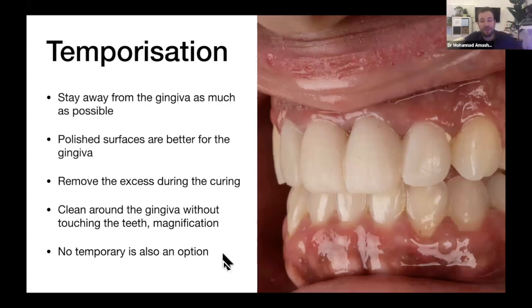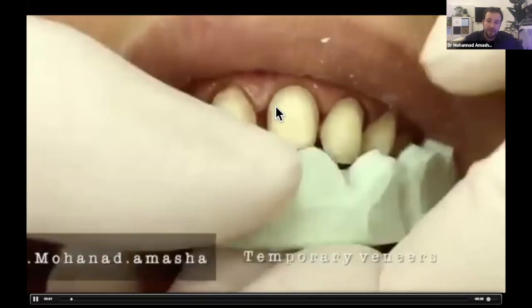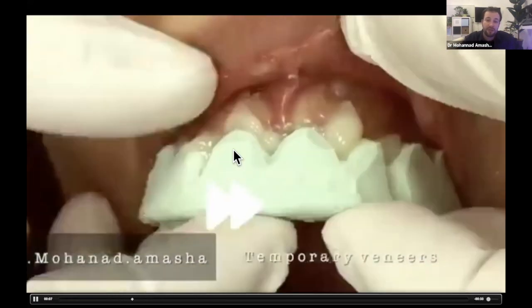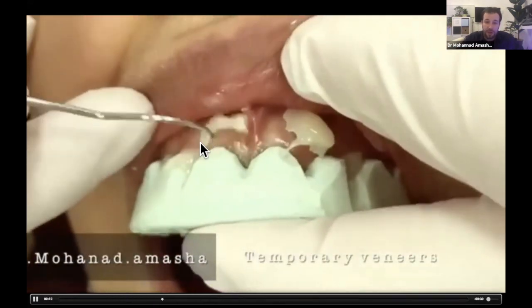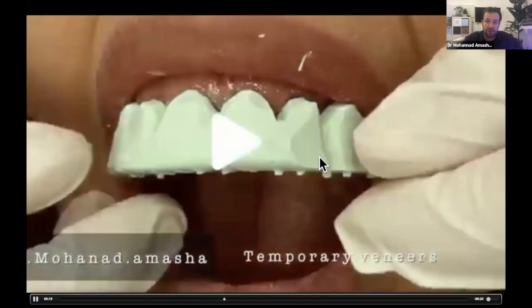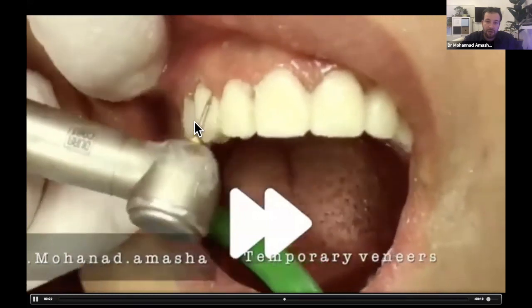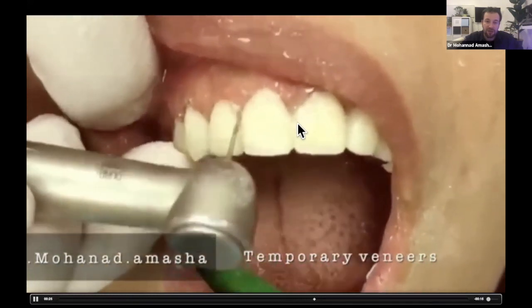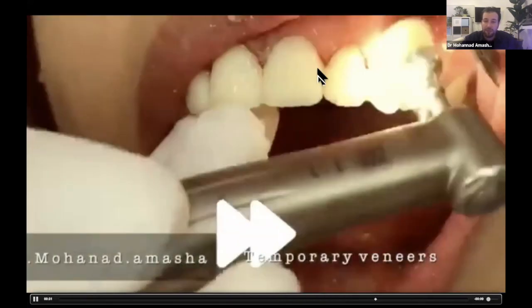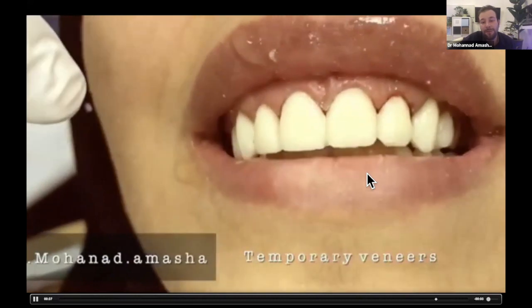If you didn't prepare much from the teeth and remained within enamel, sometimes you don't need temporaries at all — the patient can live with their prepared enamel until the veneers return. When using the putty method: place the thick, resistant putty, wait one minute, flick away the PMMA excess, then peel off the putty. Everything should be in place. Continue polishing surfaces, remove any excess without pushing the gingiva, and don't touch the teeth. That's a good temporary result.